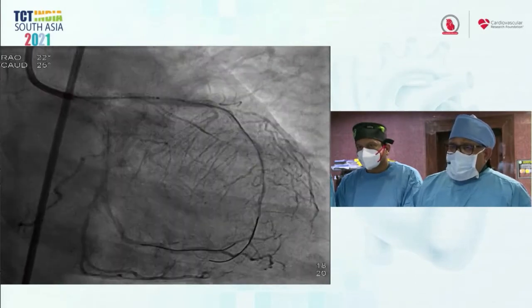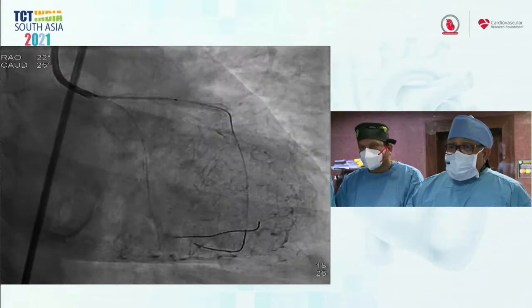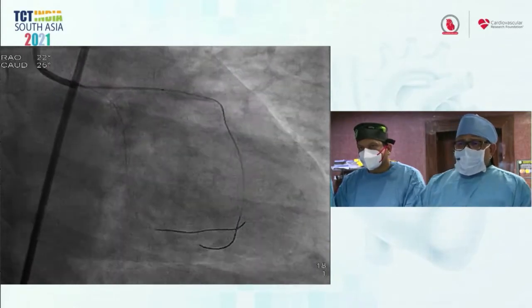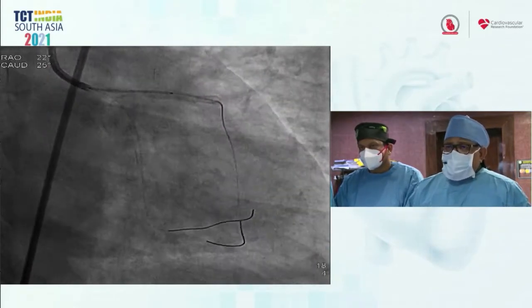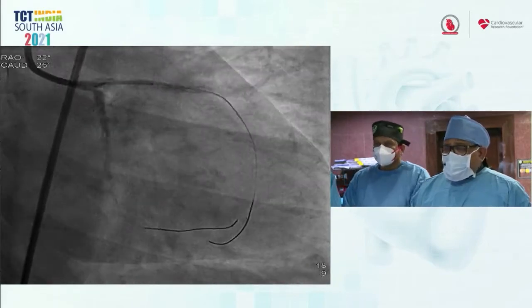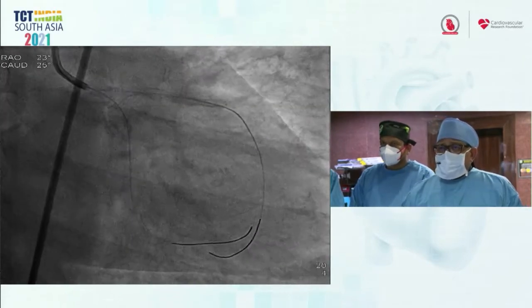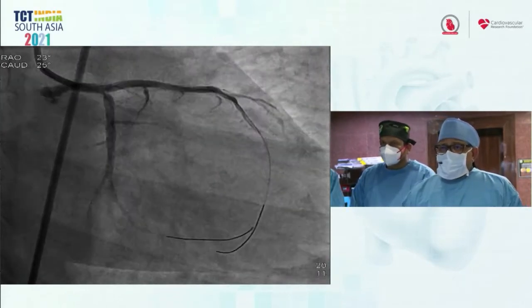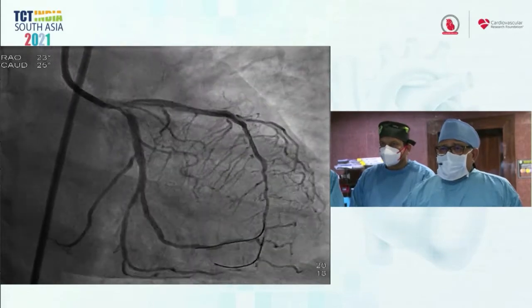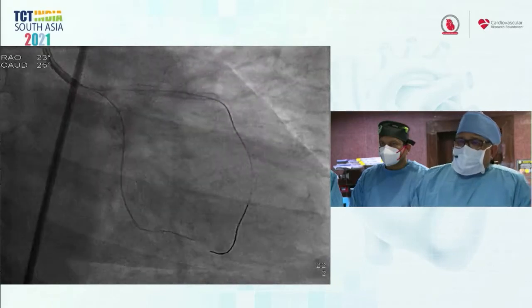I put a drug-eluting stent 3.5 across the left main to LAD. Regarding the choice of stent, which can be very well discussed, here I did put a Synergy stent 3.5 by 24 from left main to LAD. Next view, please. Next. So this is the result across the left coronary system. Next. The wire across the LCX was changed.